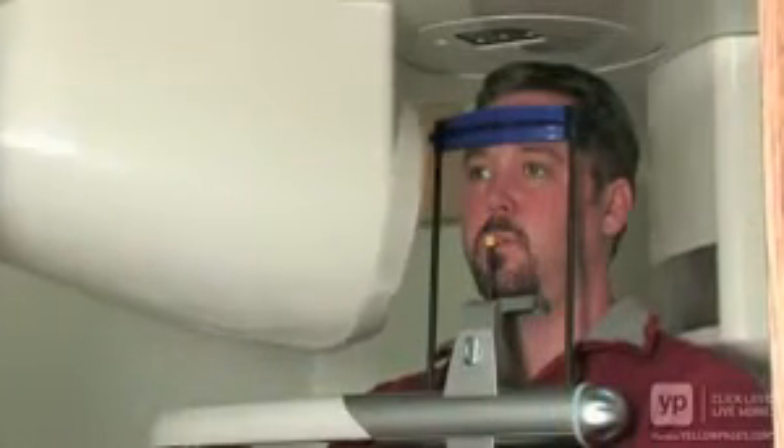This is the Galileos cone beam X-ray made by Sirona in Germany. It gives us the ability to look at the dental structures that we're interested in in three dimensions.